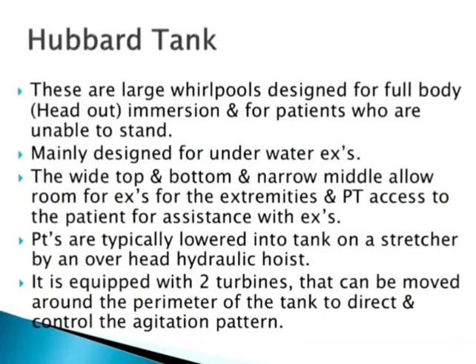So these were the whirlpools. Next is the Hubbard Tank. Now these are large whirlpools which are designed for full body, that is head out immersion, for patients who are unable to stand, and it is mainly designed for underwater exercises.